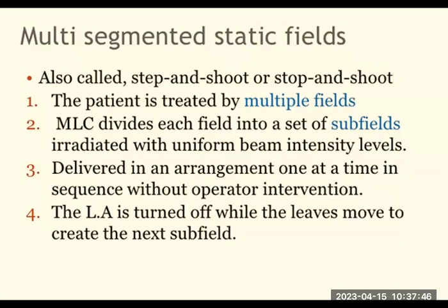During the second rotation, the next subfields can be delivered, because as the gantry moves around the patient, this is advantageous as each sequence is applied in a short instant of time. Accordingly, the delivery of the intensity beam also gets modulated with respect to the shape as the gantry moves around the patient. The linear accelerator is turned off while the leaves move to create the next subfield. This is one of the main aspects of this mode.